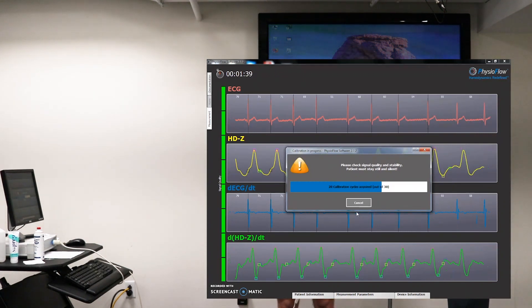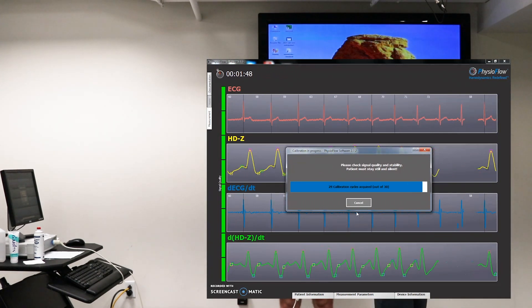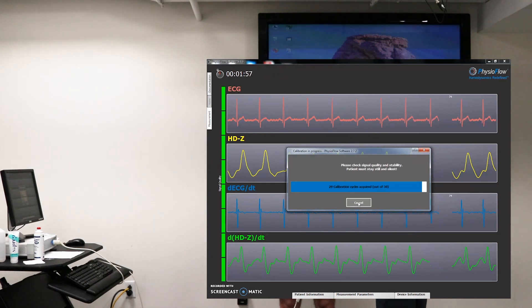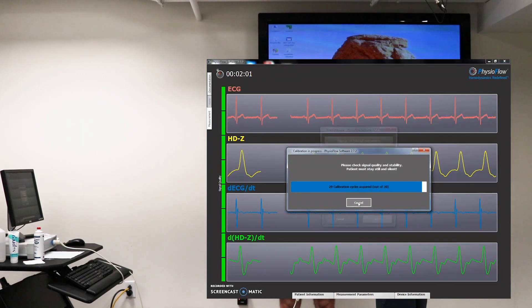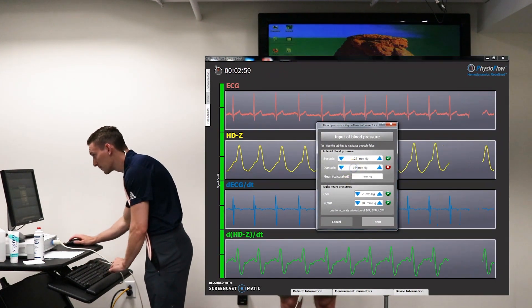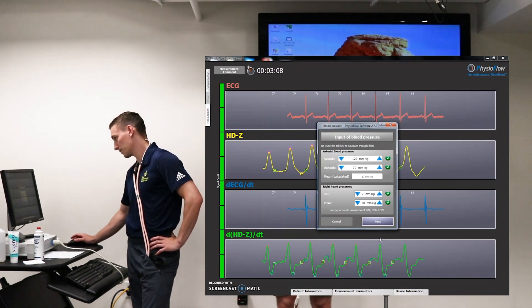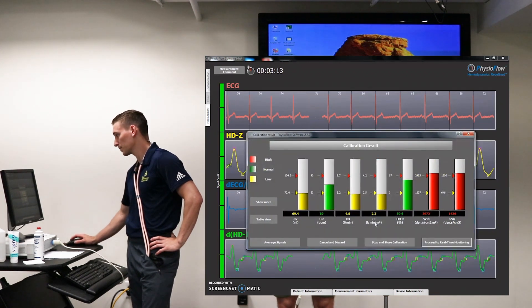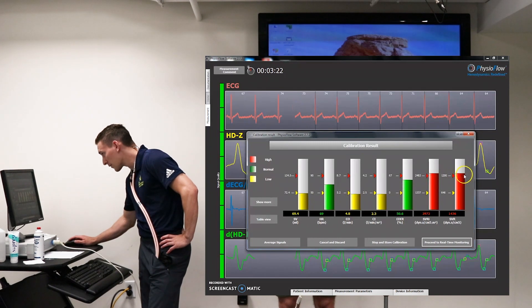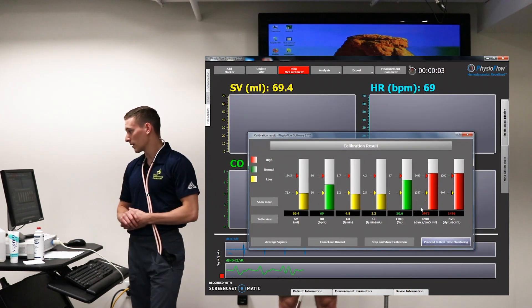As we're waiting, we'll get ready to take blood pressure. We've got 122 over 70. Go ahead and hit next. In a perfect world we'd like these all to be green, but they look okay. We're at the top end on these two, but that'll be just fine. Go ahead and hit 'proceed to real-time monitoring' and we can begin our test.